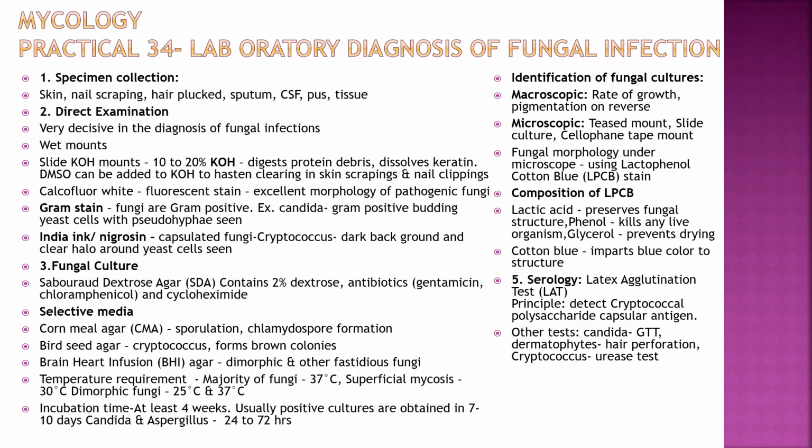Fungal culture: the common medium is Sabouraud dextrose agar, and selective media like cornmeal agar and birdseed agar. Then identification of the fungal culture: macroscopic by rate of growth and pigmentation, and microscopic by making a slide and doing an LPCB wet mount. You can see blue colored colonies, and according to the structure you can identify them. Other tests include, in Candida, the GTT, that is germ tube test, the hair perforation test for dermatophytes, and the Cryptococcus test.